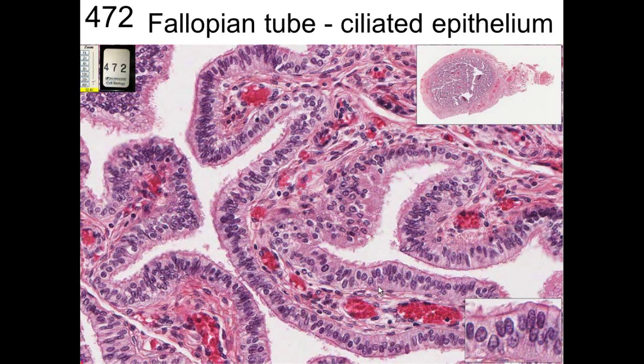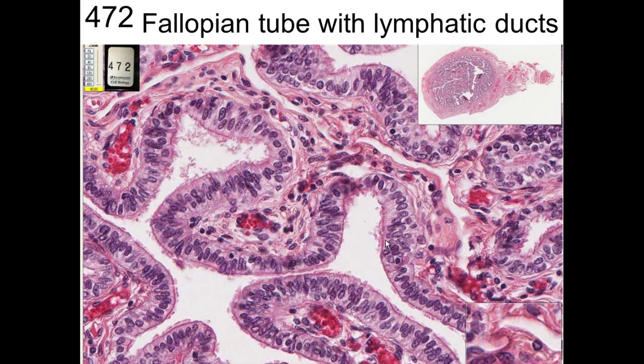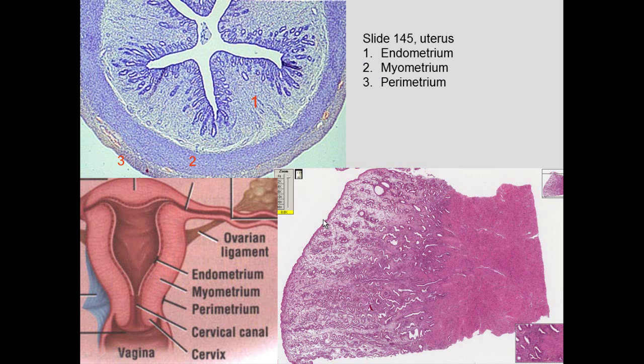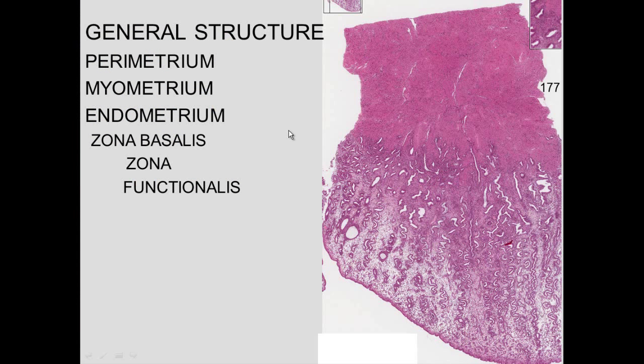Columnar epithelial cells. Again, you can see the ciliated cells. They're not every cell, but they're intermittent among some mucus-secreting cells. The fallopian tube is here. You can see the big lymphatics that run through there, but the epithelium and connective tissue that we see there. Eventually, as we get to the uterus, we see myometrium, perimetrium, and the endometrium. Endometrium is in through there.